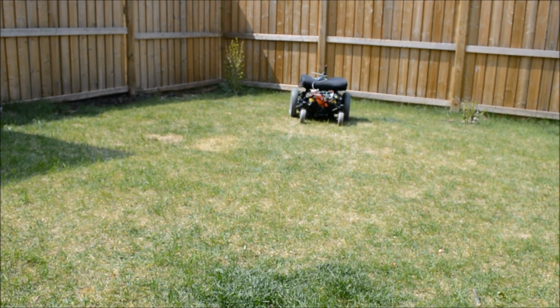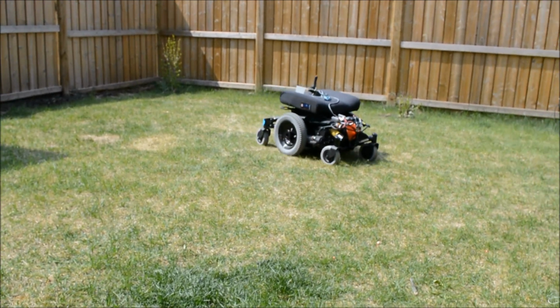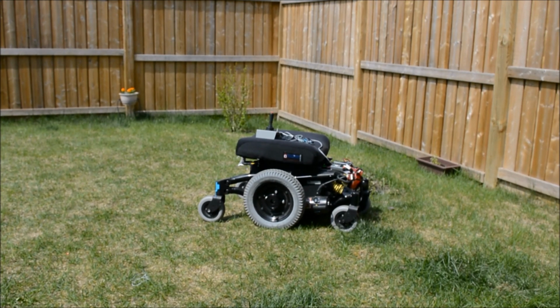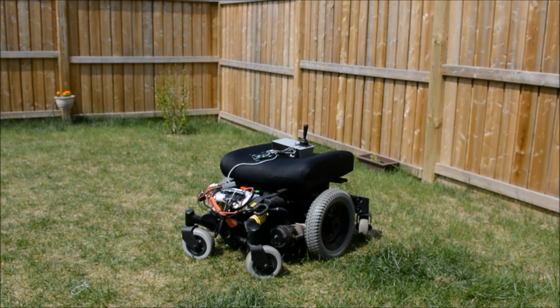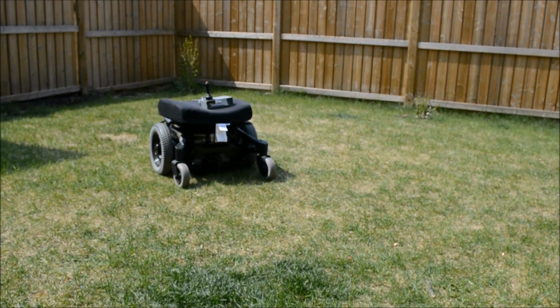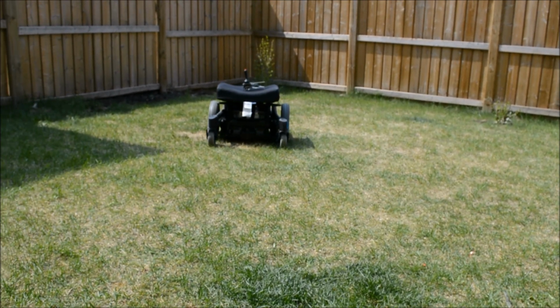If I stop it, I can go forward plus, and then I can also go left, or I can go right while it's moving forward, and I can stop it, and I can fully move it right. And if I want to go forward from there, I can move the wheelchair forward. And then if I want to go forward right, I can slowly go forward right. And I want to bring the wheelchair back, so I'm reversing it.